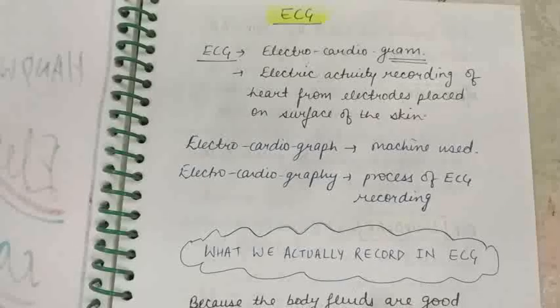So in this video, we'll be talking about some basic concepts of ECG, what an ECG wave is and how it's being generated, right? Or if, for example, you get some question on ECG, how you have to perform that, okay? So this will be a brief description about ECG.